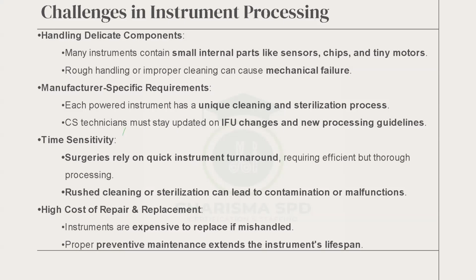You will find people hiding behind that when you start working to cut corners. And when you cut corners, what happens? You get into trouble. You get brought to your manager's office. Nobody wants to do that. Rushed cleaning or sterilization can lead to contamination or malfunction. So even though you don't have enough and you have overbooked the surgeries, you still have to do it the right way.